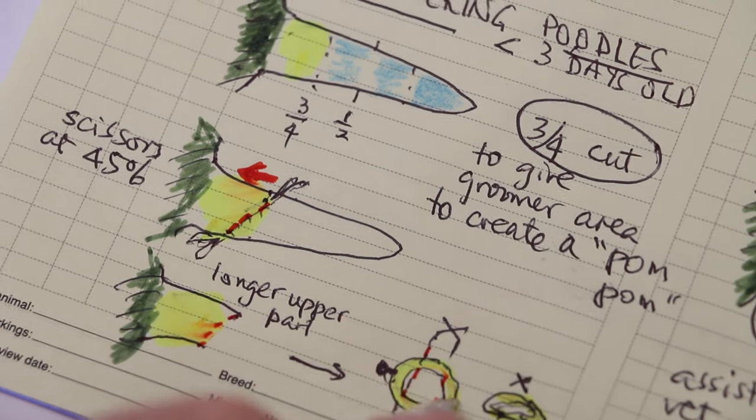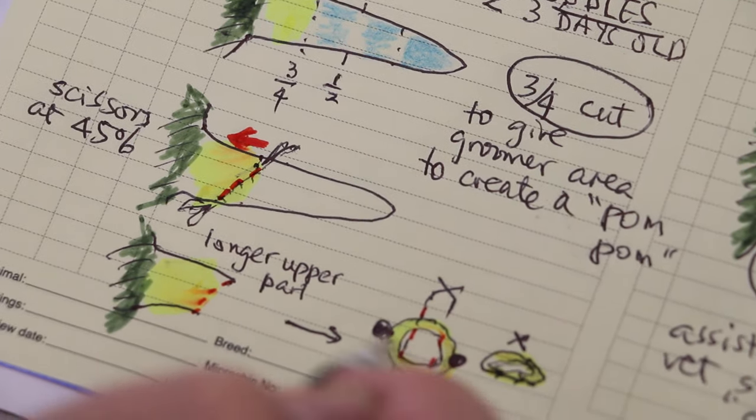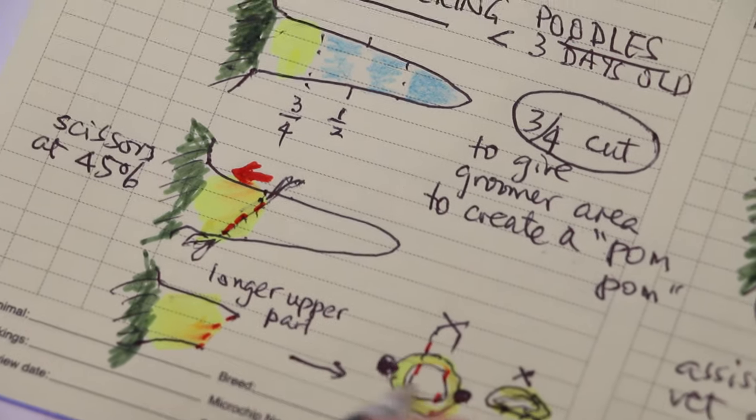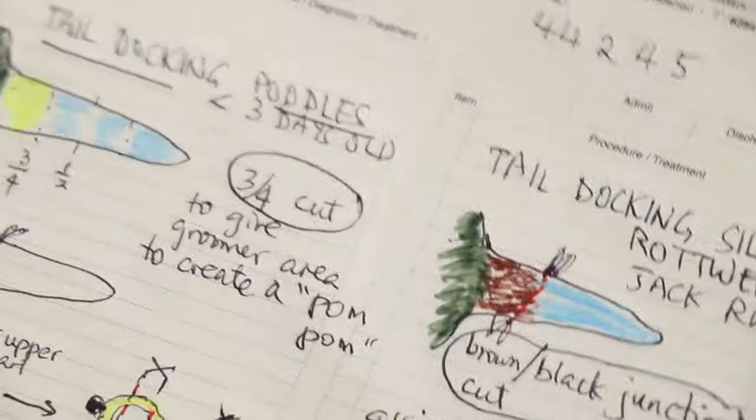The assistant will press here and here, and the bleeding will stop because the blood vessels come from these two lateral blood arteries and veins. You stitch up. After you stitch up, there should be no more bleeding.